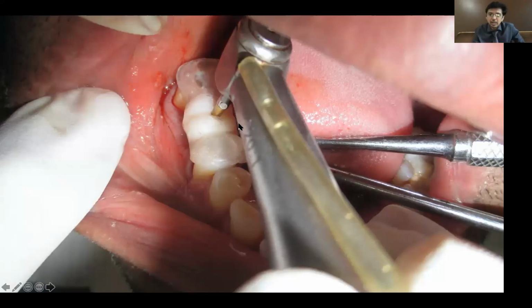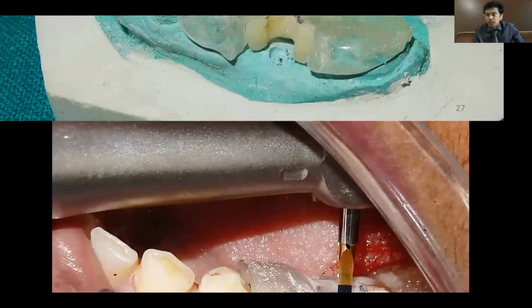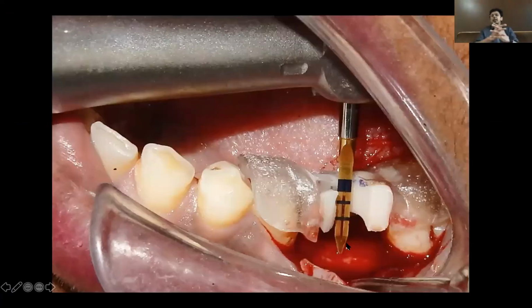Ultimately, we did a smart thing. We started removing the buccal part of the surgical stent. The advantage of this was, whenever you use it during surgery, you'll be able to see where your drill is actually hitting the bone. So this goes for the first take home point. Whenever you are using a surgical stent, always and always use either transparent acrylic or at least the buccal part of the stent should be removed completely. That is the first point.